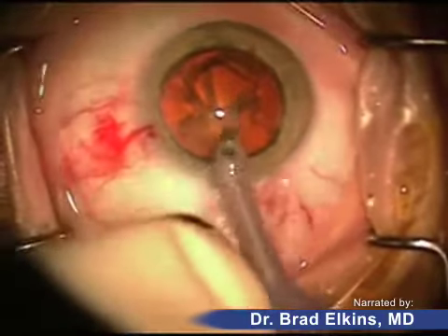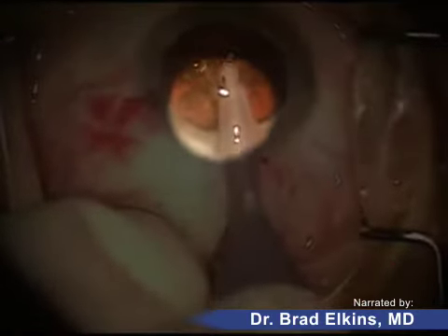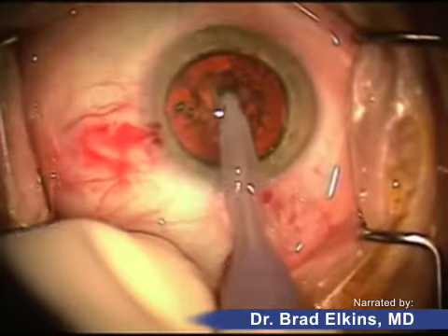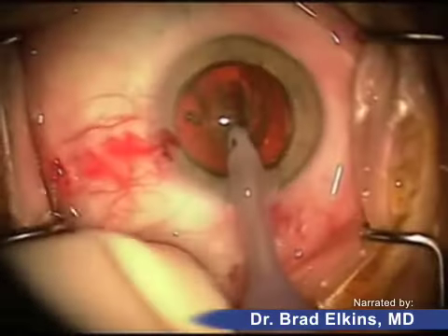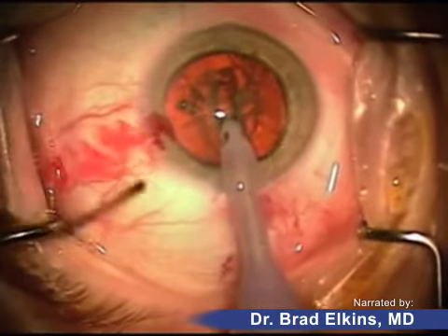This is called phacoemulsification. It's about the size of a pen tip, and the front part of the instrument is like a little jackhammer. It moves back and forth very rapidly as well as rotationally from side to side, and it creates sound wave bursts which break the lens up into small fragments.